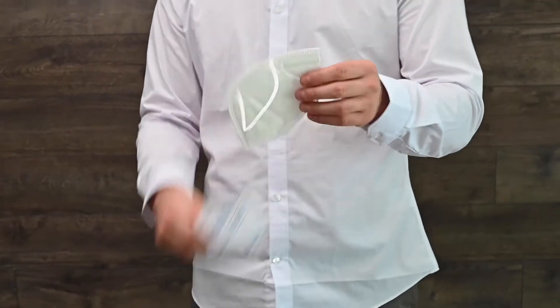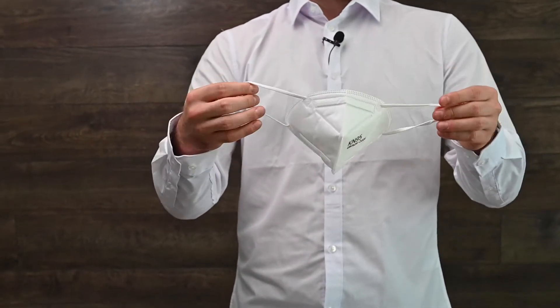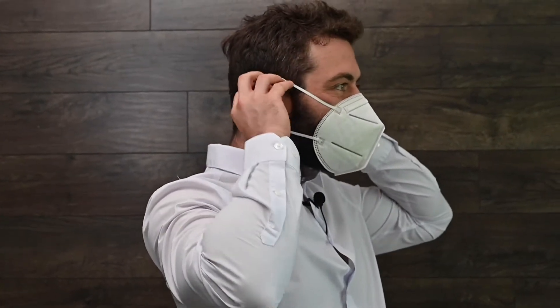Okay, so this is what you got. You see two loops here for each ear — very easy to put on. Just like that, over one ear, over the other. That's the KN95 mask.